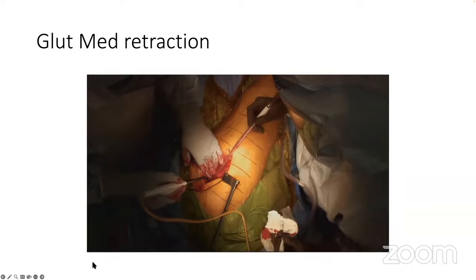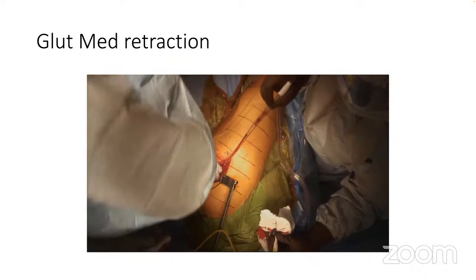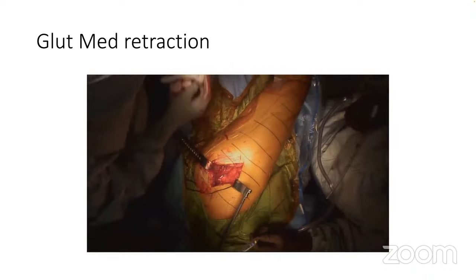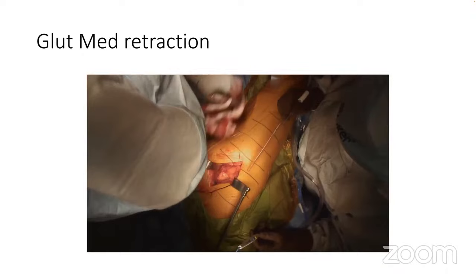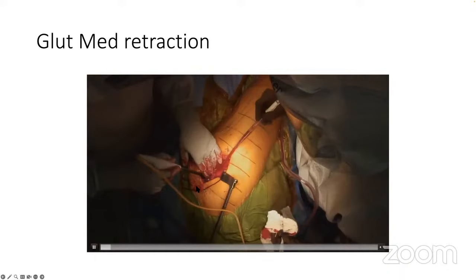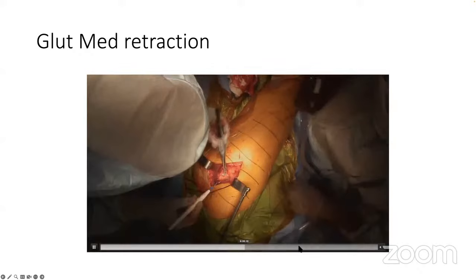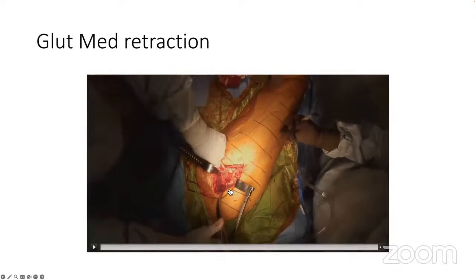The next step is to place the retractor under the gluteus medius — a simple step that helps quite a bit with exposure of the rotators. I use a lap or gauze to push the fat pad out, which allows the rotators to be exposed well. You can see the margin of the gluteus medius, and then it's simple to insert the retractor right under it. This elevates the medius and exposes the rotators and gluteus minimus.